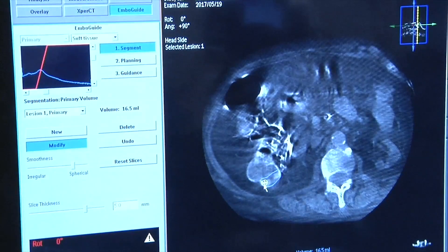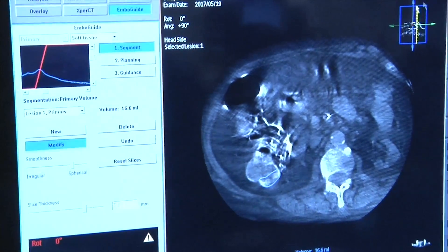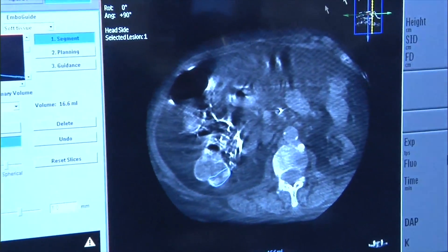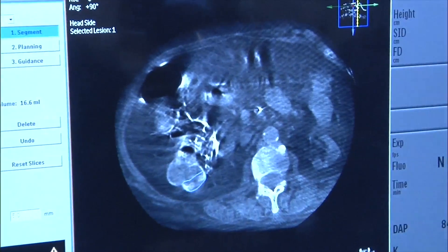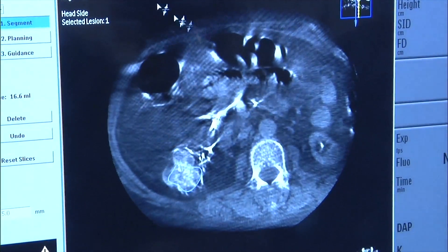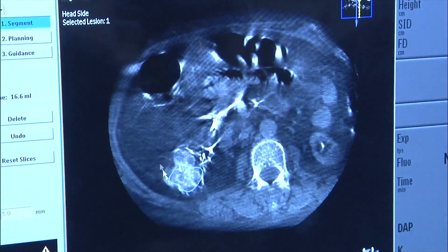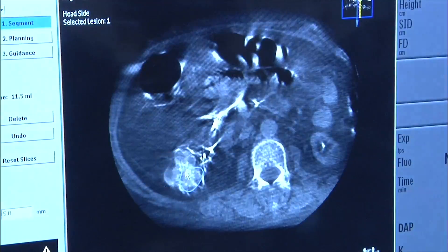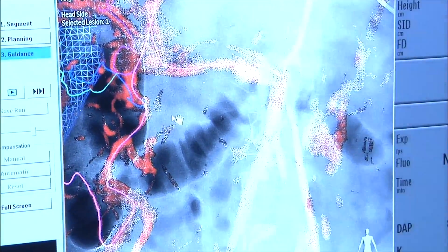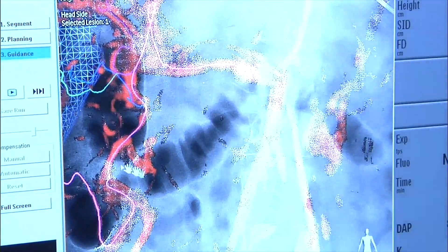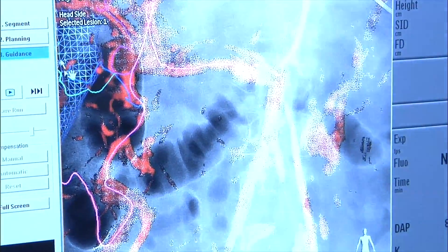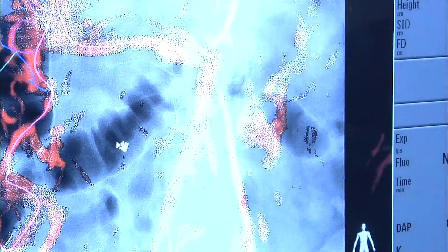The question now becomes: what should we use as an embolization agent? We can use glue, we can use coils. Because we're not exactly sure of the exact artery, we're going to drop the coil right here where we are. We're going to use a Concerto coil because we don't have a really long landing zone here. So we're going to take a really soft, short coil and go from there.